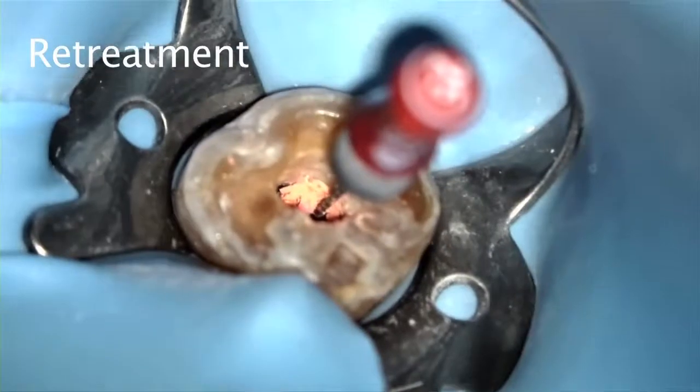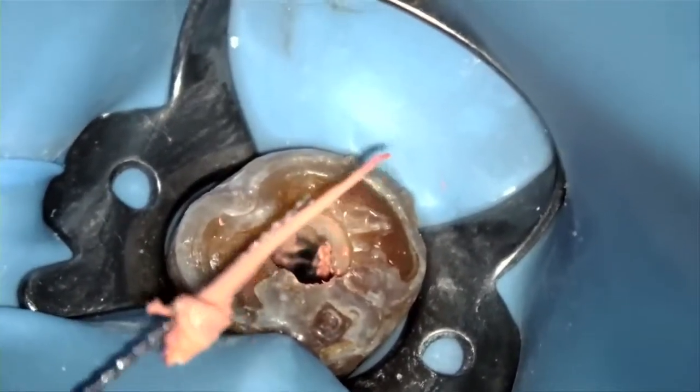Now I'll speak about retreatment. In the unlikely event you need to remove your gutta core, I recommend using a Hedstrom file for engaging and removing it. As seen in this video, turn a Hedstrom file in a clockwise direction to engage into the gutta core and pull the file coronally. This is very easy to perform, especially before the gutta core has fully set. If or once the sealer is fully set, you may retreat the gutta core the same way you would any other gutta percha-based obturations.